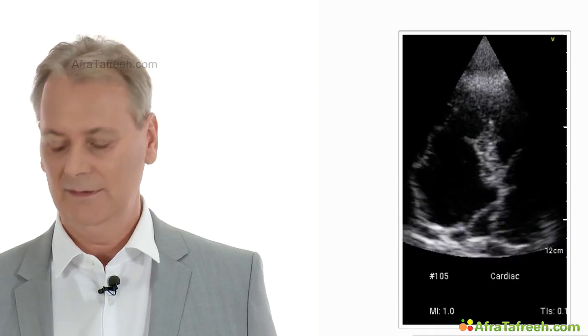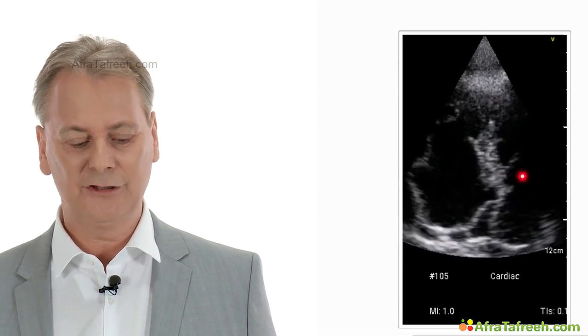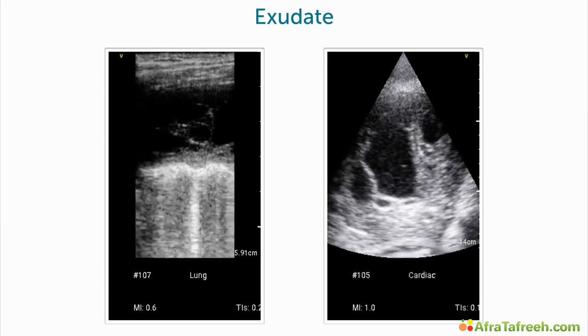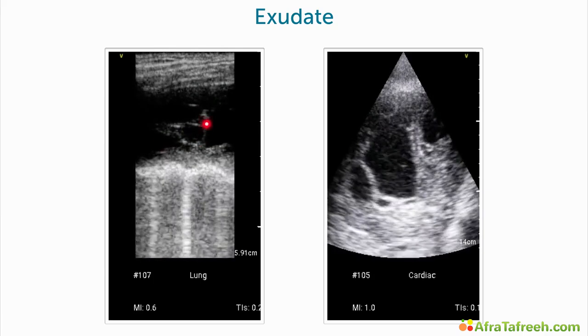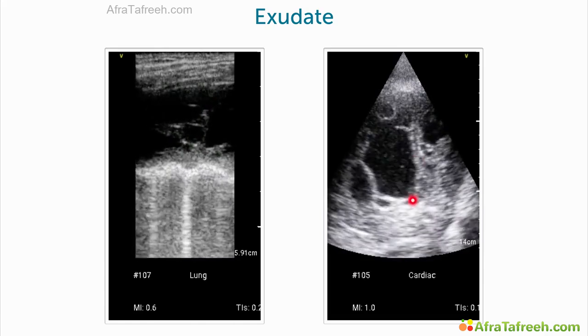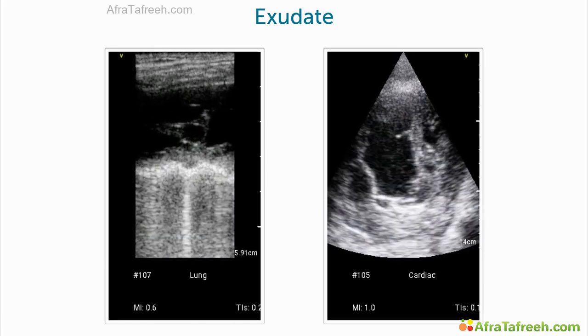Another example, fibrous strands, a chambered pleural effusion, an exudate. The same patient imaged now with a linear transducer, pleural effusion, and fibrous structures within this pleural effusion, exudate. Right here, you would see massive, partially organized pleural effusion already.